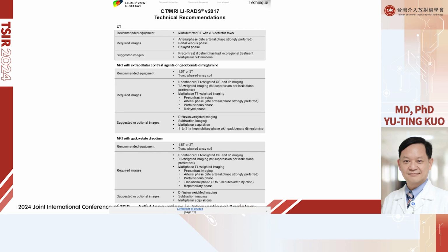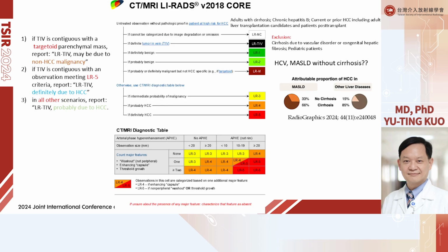LI-RADS also details the technique, such as how we do a multi-phase CT and a multi-phase MRI using extracellular agent or tissue-specific contrast agents such as Primovist. This is the outline. We have the LI-RADS 2018 core diagnosis algorithm, step by step, from LR-TIV to LR-5.